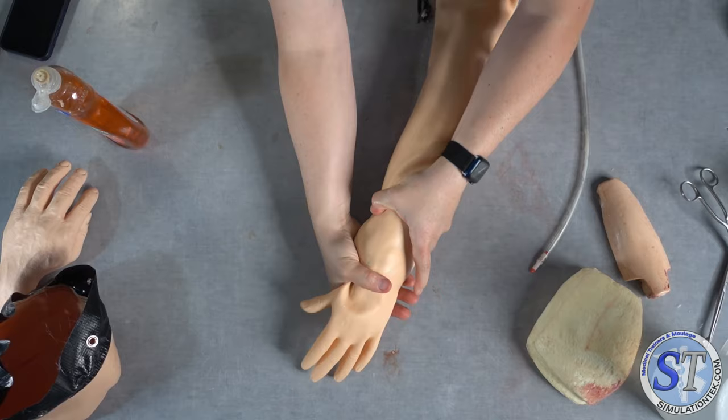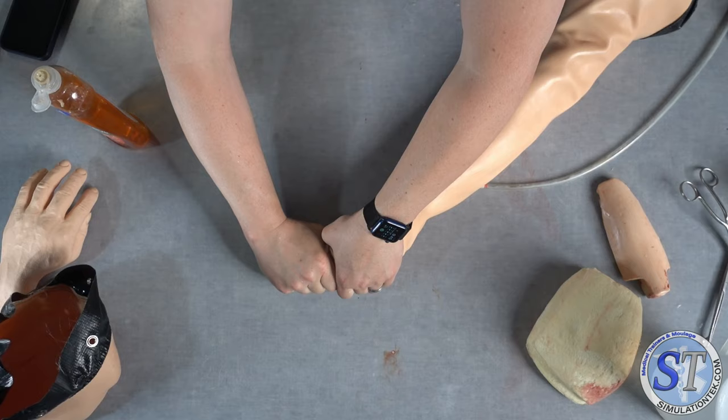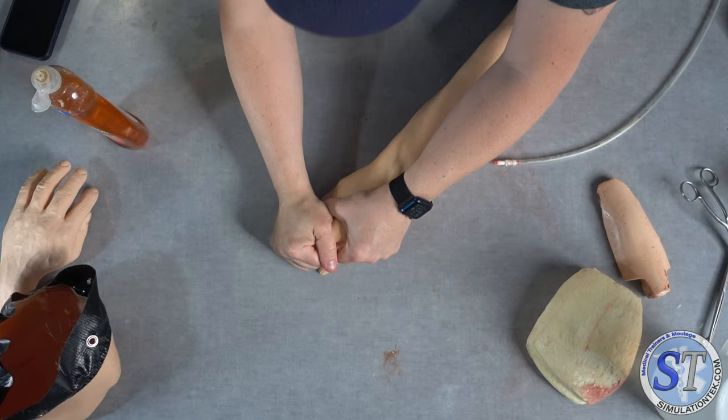And if you feel resistance, if you feel like it's not sliding, add more water. This is why I did a syringe or I do a chest tube or something like that, because I want everything to be slippery slidey. You can also heat these up a little bit. I've never done it. I've seen it done by a few other people that are awesome, and it works.